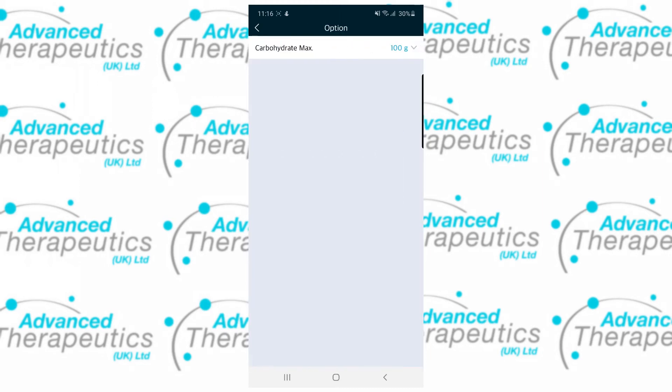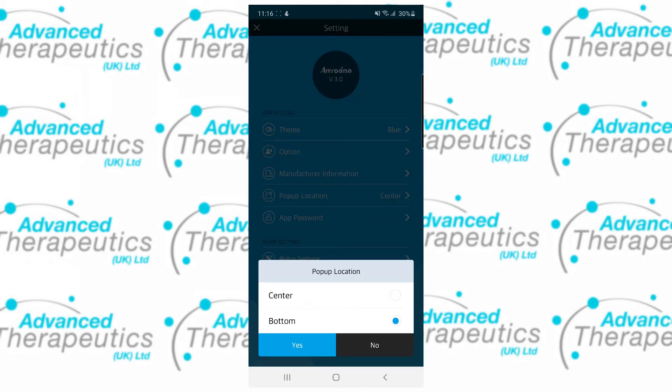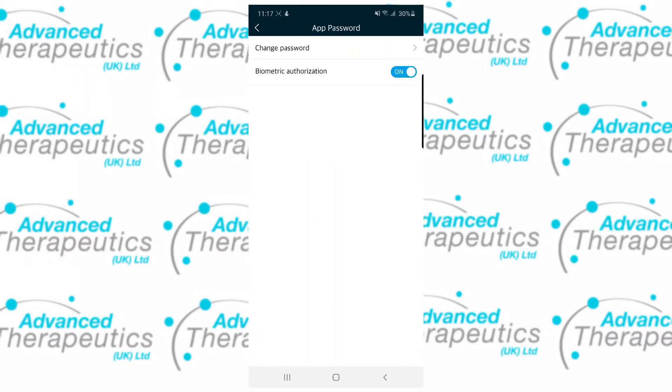The Option setting allows you to set a carbohydrate maximum for use in the bolus calculator. Pop-up location determines where pop-ups will appear, and app password allows you to change your password or switch on and off biometric authorisation.